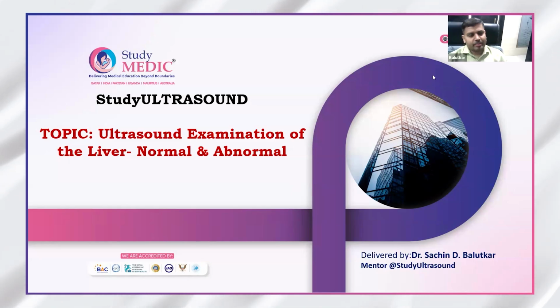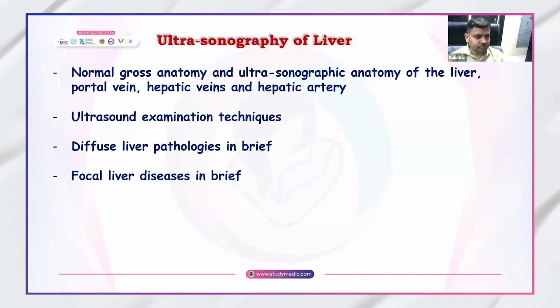In this session, we will be discussing the ultrasound examination of the liver. We'll be discussing the normal appearance of the liver on ultrasound examination, and the ultrasound examination techniques, and then in brief about some pathologies. The pathologies we'll be discussing in two sessions, which will be diffuse liver disease and the focal liver disease.